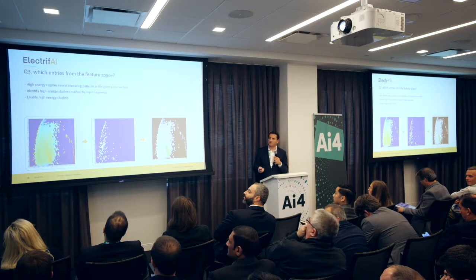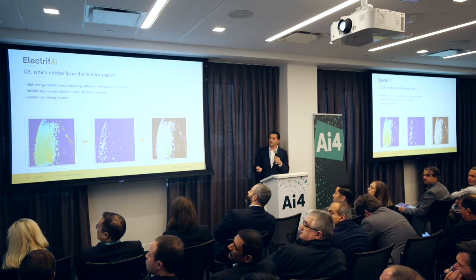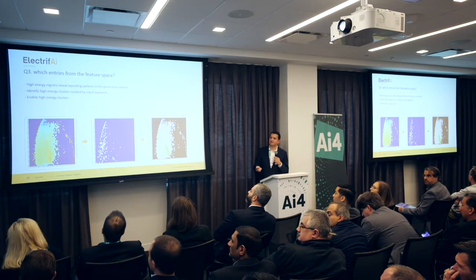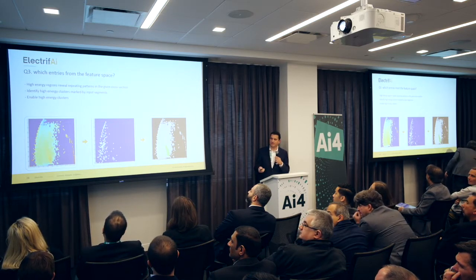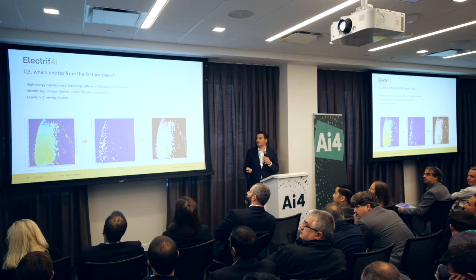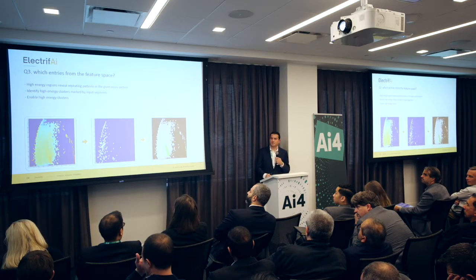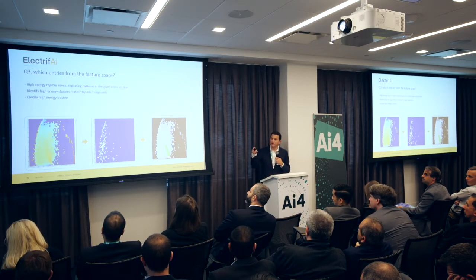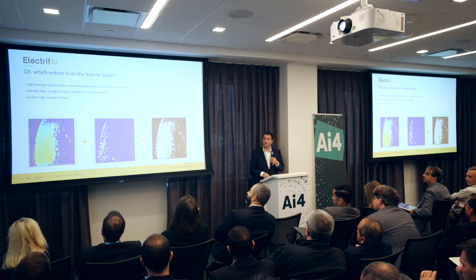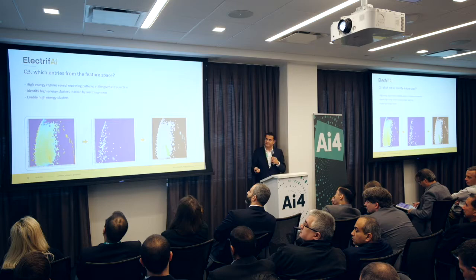And this is noise pretty much. So we're interested in this cluster there that coincides with that pattern. So we have an algorithm that will give us this as the trace of this specific high energy area, or you can do that manually. If you have complete absence of such expertise in your lab, you can actually go over there and click. That's why it's called the switchboard, because you can click on those entries and you can do that manually yourself.